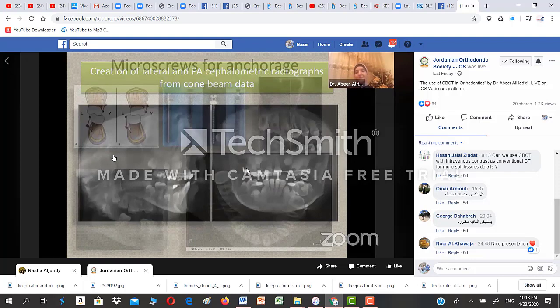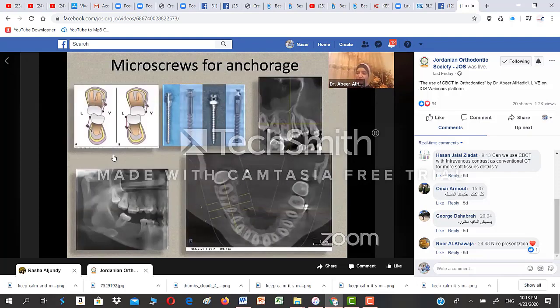I know a lot of people would say, mini screws, not really, it's such an easy thing to do. Maybe I don't want to expose my patient, especially young people. I totally agree with you. But if you're using a plate, for example, or if there is something interesting regarding the root morphology or shape of that arch, something that is a bit out of normal, there are numerous articles in the literature talking about the potential use of cone beam if you're thinking about extra anchorage that is derived from the bone, so you know where to place it and do not damage adjacent structures, for sure.